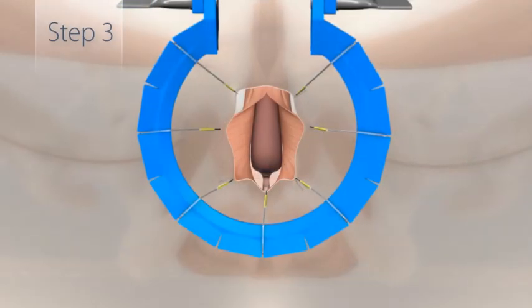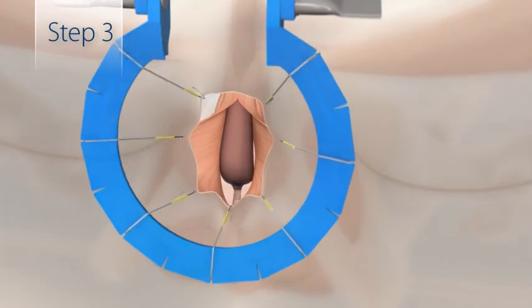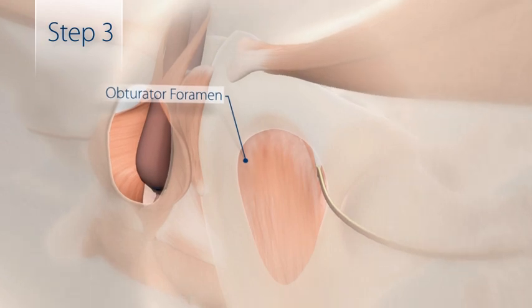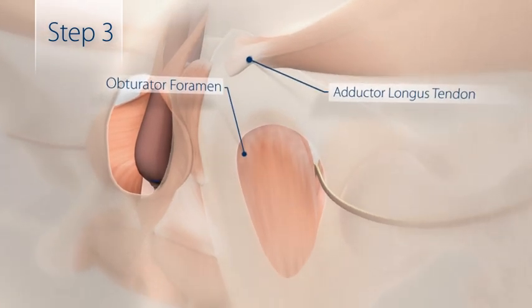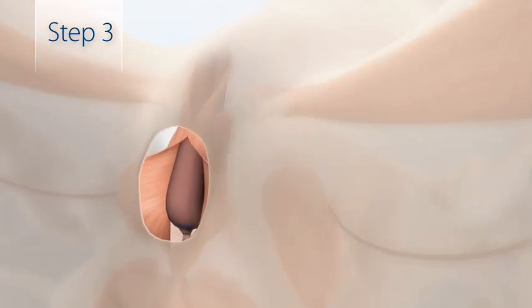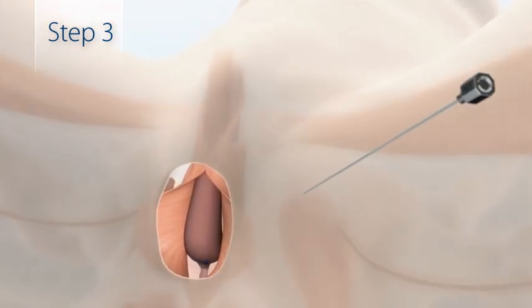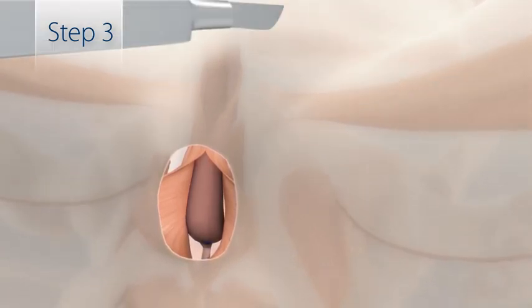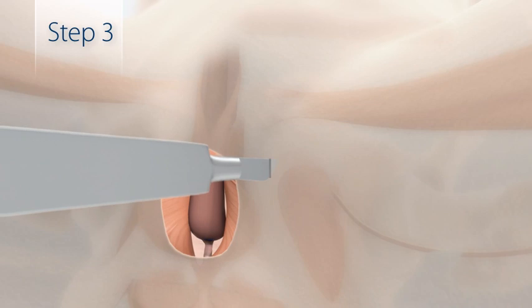The AdvanceXP helical needle passer will be inserted into the obturator foramen about 1 finger breadth below the adductor longus tendon, just lateral to the ischial pubic ramus. To identify the proper insertion site, palpate the inferior pubic ramus and feel for the bony landmarks. Make a small stab incision at each needle entry point.